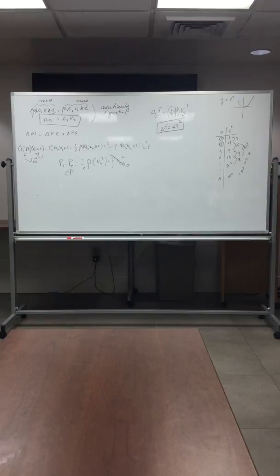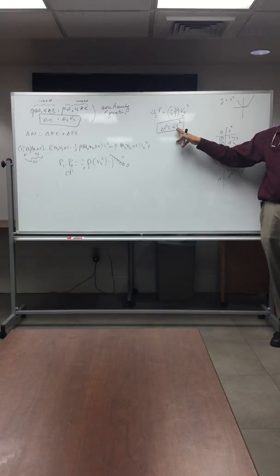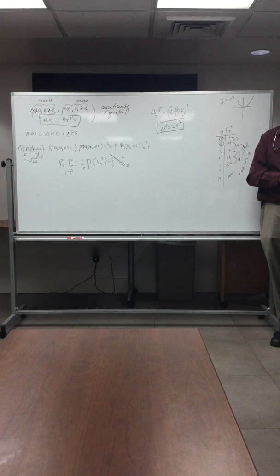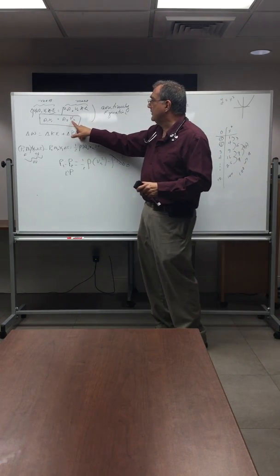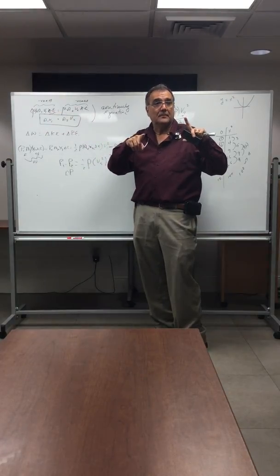The aortic valve reading is not supposed to be more than 16. If you have 2 times 2 is 4, times 4 is 16, anything above 2 meters per second already begins to give you aortic stenosis using this equation. And this is, by the way, what they use on the echoes to calculate the valve area. They calculate the valve area in aortic stenosis by measuring the velocity above and below the valve.